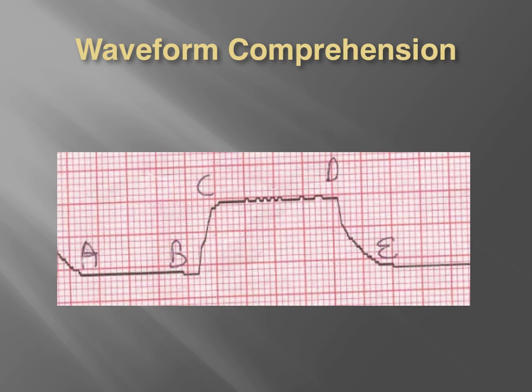Moving right along, let's remember that D down to E is our inspiratory phase, and from E pretty much to B really is what we're talking about. That's kind of like that post-inspiratory phase where we're maybe holding our breath in, and then B to C is that first bit of exhalation, and then that alveolar plateau, which we just mentioned in the previous slide. Okay, we need to think about that, and every once in a while we need to think about how we breathe. Okay, from D to E, we breathe in, and from B, C to D, we're breathing out.